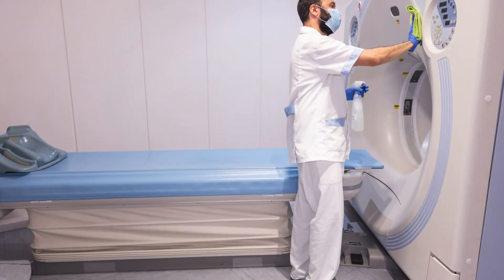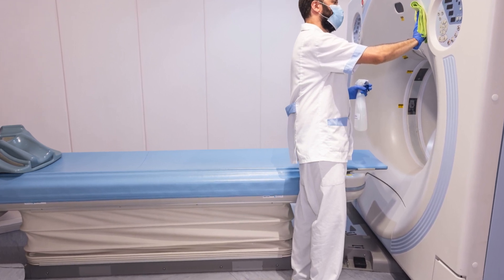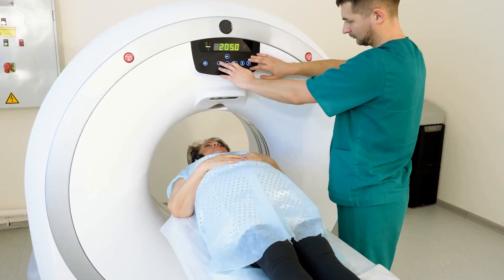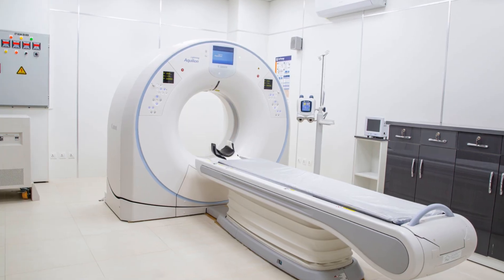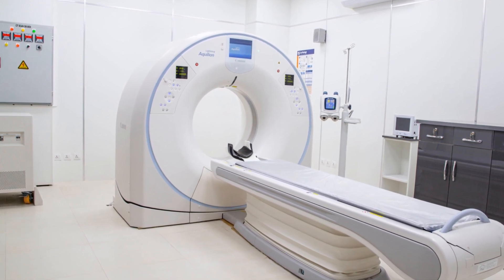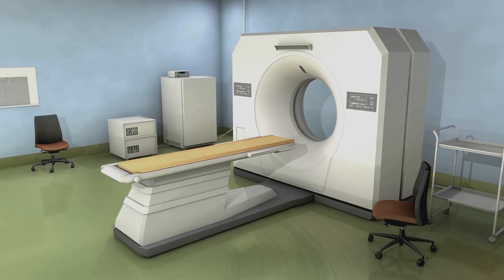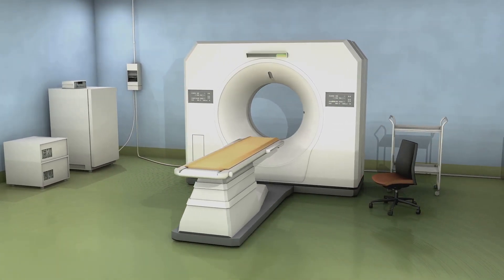Before diving into diagnostic and repair procedures, it's crucial to understand the key components of a CT scanner and their functions. Familiarity with these components is fundamental for effective troubleshooting and repair. The gantry is the donut-shaped structure that houses the x-ray tube, detector array and data acquisition system, or DAS. The gantry rotates around the patient, capturing x-ray data from various angles.